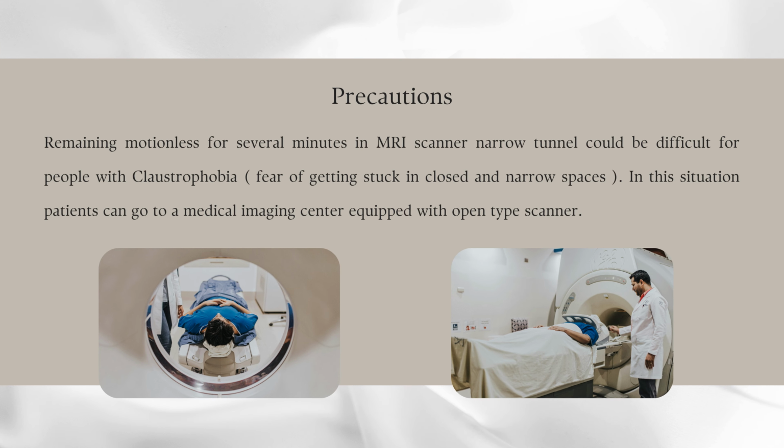2. Remaining motionless for several minutes in the MRI scanner's narrow tunnel could be difficult for people with claustrophobia, which means fear of getting stuck in closed and narrow spaces. In this situation, patients can go to a medical imaging center equipped with an open-type scanner.